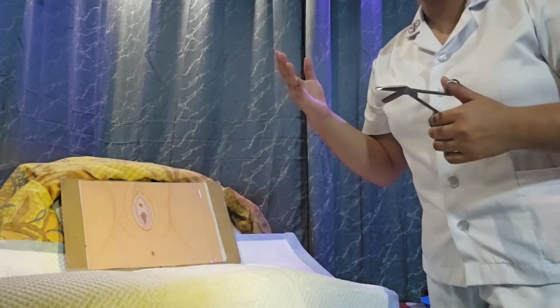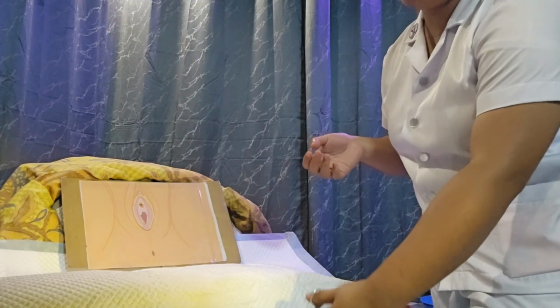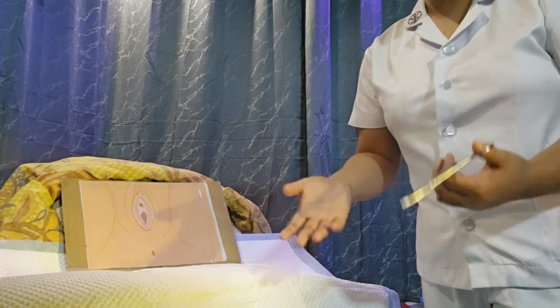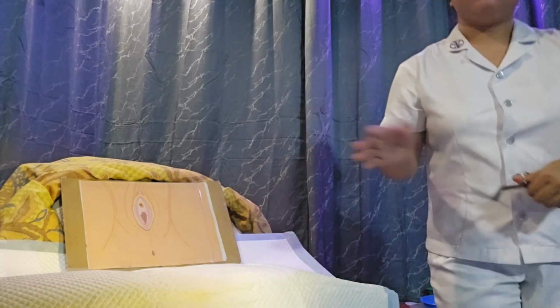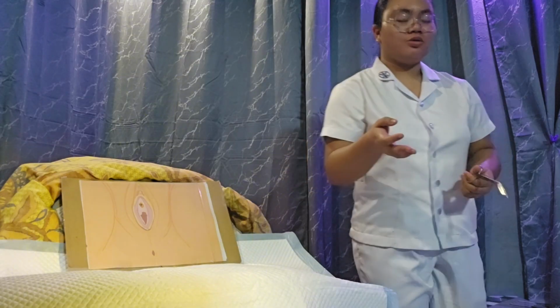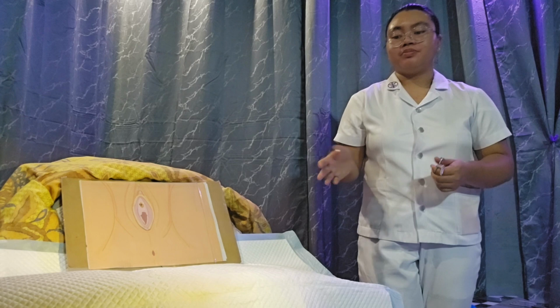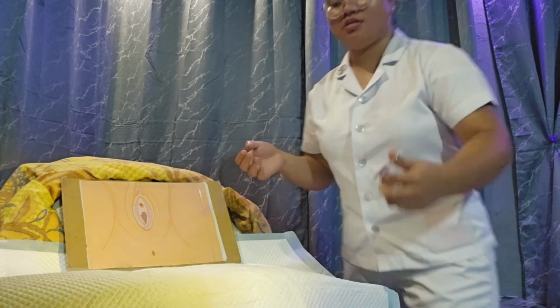So we need a lubricant, a specimen container, a catheter, the urobag, as well as the eye sheet, sterile water, syringe, as well as the sterile gloves. So after that, we are now going to wear working gloves. So this would allow us to prevent contaminating the sterile items.